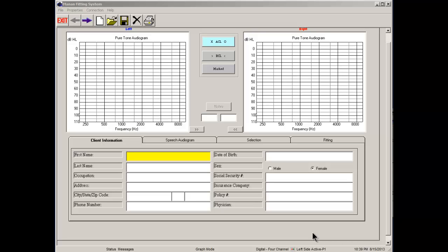In this video, I'm going to show you how to get past a persistent glitch that happens whenever you're trying to pull up old data and restoring data back into the hearing aid from a previous fitting session. So when you open up your Manan fitting software, you're going to come to this screen right here, which is a blank client information screen.